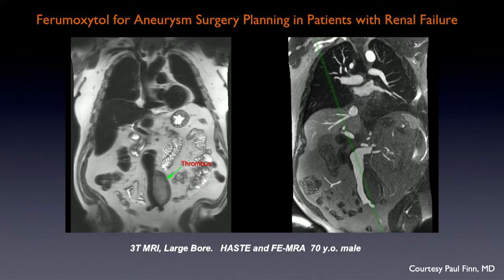I have a couple of slides from Paul Finn highlighting the utility of MRA for TAVI vascular access planning. The last author showed some applications of this up in the chest, but just leaving the annulus alone right now, just dealing with the peripheral access vessels. This is a nice technique.